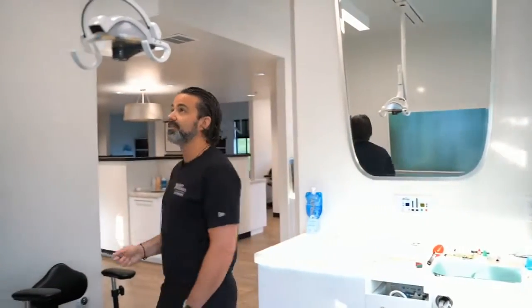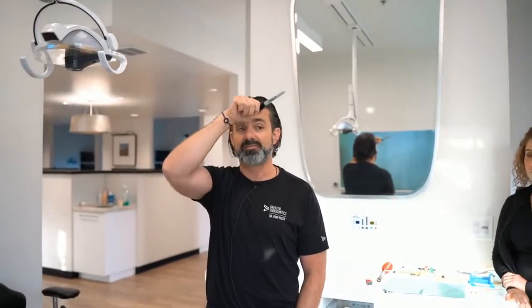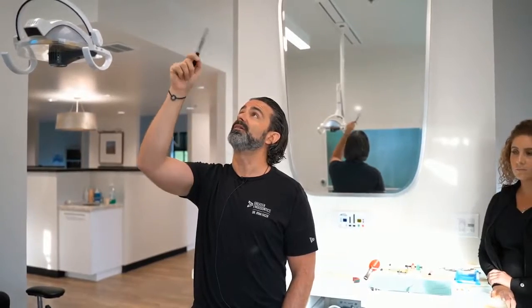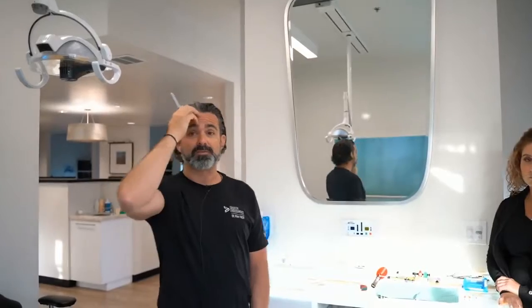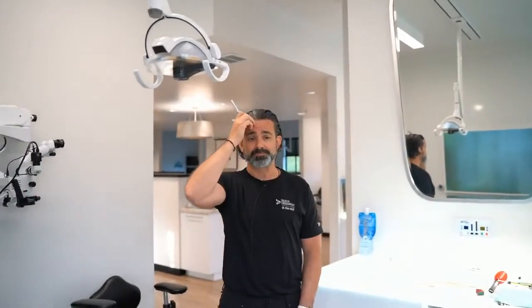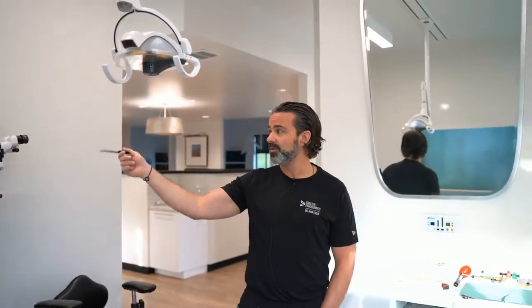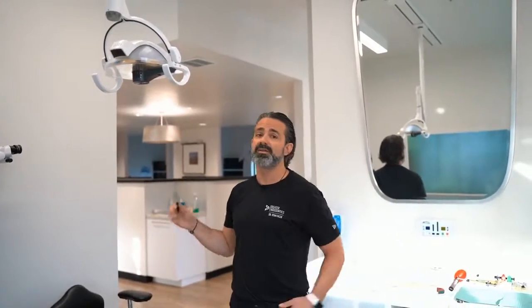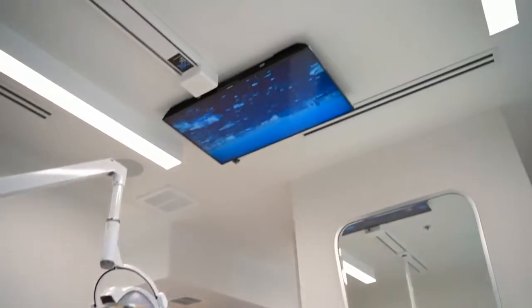So that's one thing. The other thing is if you go from the ceiling, you really need to reinforce the ceiling for the same thing. If your building has compressors and things, right now I'm on the 2nd floor of the building, and sometimes that's an advantage. However, I've had a lot of luck from the ceiling. In this office, I went to this 3 o'clock wall right here. And partly that's because in this operatory room, I wanted it to be very open, and it's very clean and light.